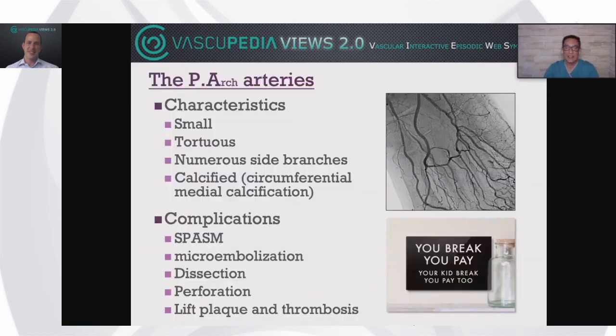Okay, so due to the specific features of plantar arteries, this procedure is not always a straightforward maneuver, because they are quite small and tortuous vessels with numerous collaterals arising from them. There's a quite typical calcium pattern, which is the medial artery calcification, and as Lorenzo always mentioned, this is related with a rough intima, which is prone to be dissected.